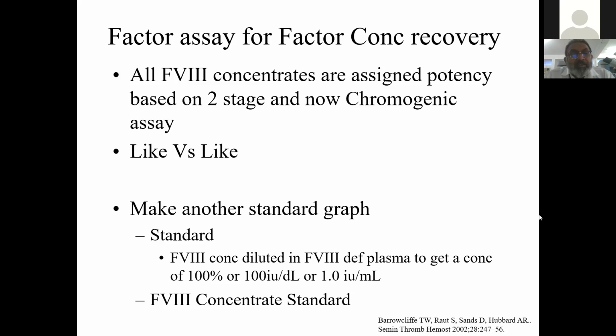So you must realize that a lab which is accredited, which is participating in a good quality assurance program, and assigns values for NIBSC standard, is fairly confident about their quality. Now, when they give a result out, it is understood that whatever factor VIII was in the sample is the value that you obtain. But when they say that no, we wanted to give 100%, you have given a result of 45%, you must realize that there is something that you need to clarify before you repeat another assay.